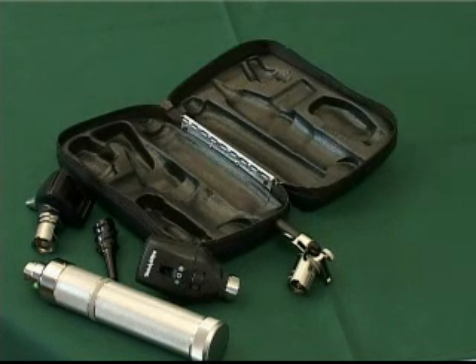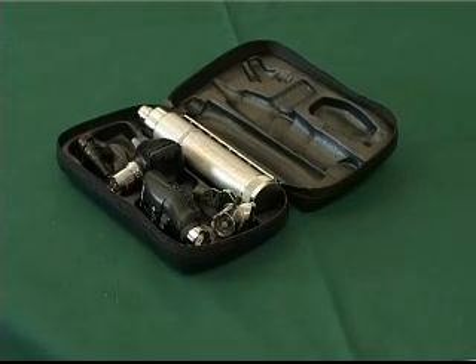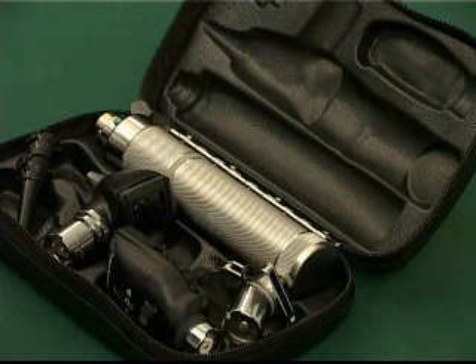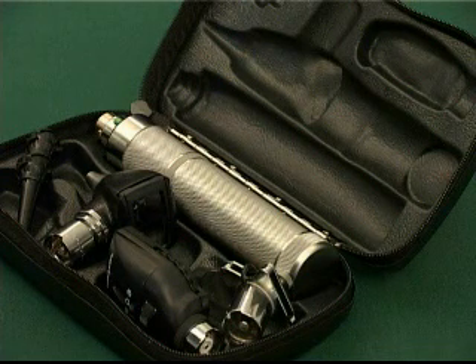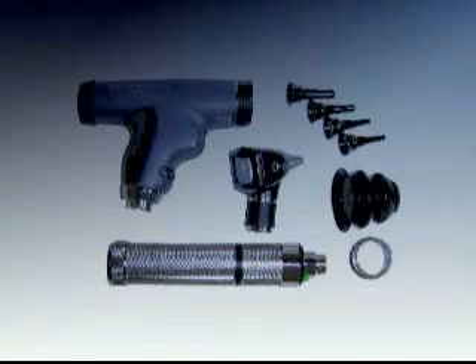A diagnostic set typically comprises a power handle, otoscope, ophthalmoscope and, in some cases, a tongue blade holder. The diagnostic set forms part of the equipment used on a daily basis to perform basic clinical examinations on patients. There are various makes and types of diagnostic sets, all of which perform essentially similar functions.